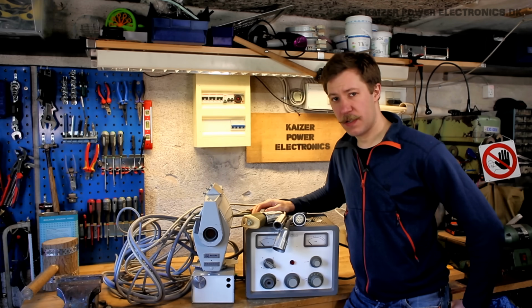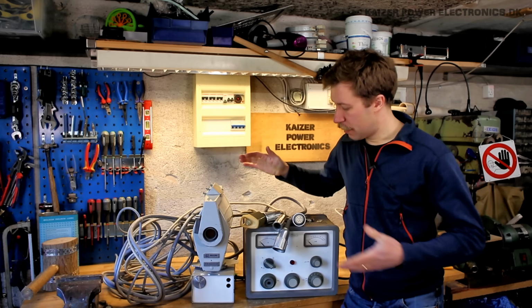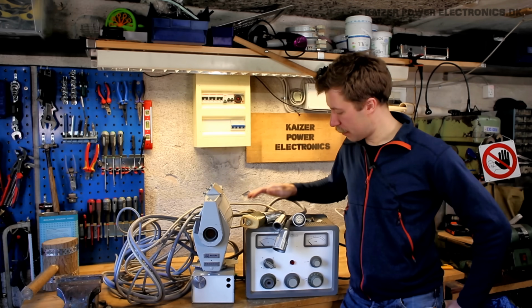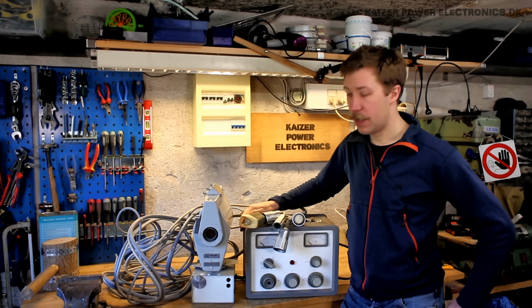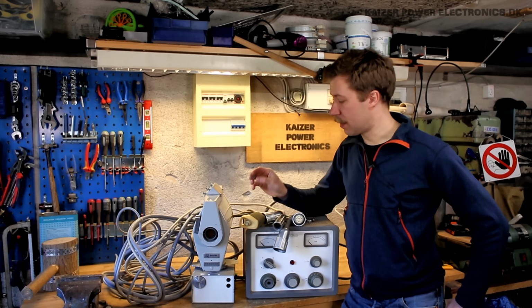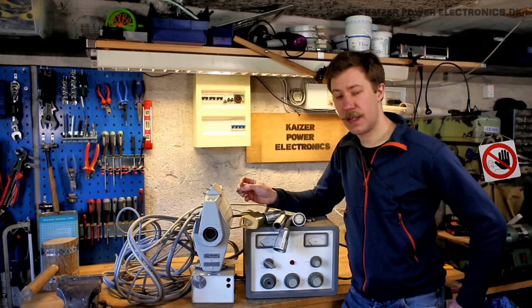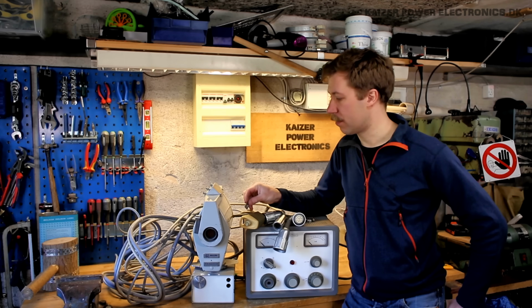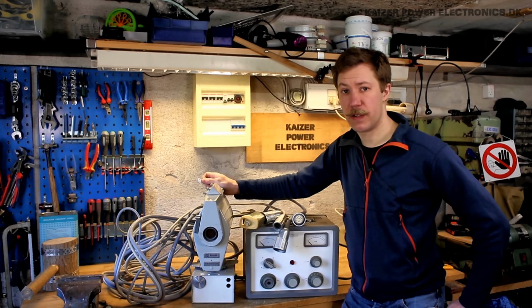So I have no intentions of doing my own X-ray shop, so I'm going to take it apart, keep the high voltage gear of it, and of course this nice controller box here will probably make a nice demonstration unit on high voltage experiments. From the sticker on it, we can see this was last calibrated in 1999, where it was mostly thrown out some 2 to 4 years later. So it has not been in service for something like 15 years.